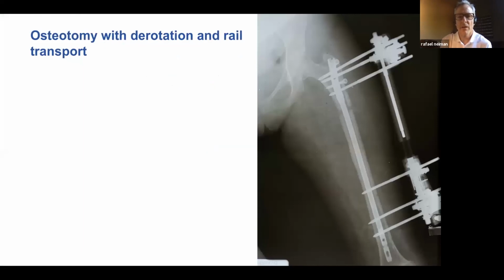She does get a rail, but with an intramedullary nail. This is the smallest nail that I could get for her, which is still kind of big. I think it's an 8, and it happens to be a tibial nail. Is that a problem, to have a big nail with these pins? It certainly is harder to avoid having the pins cross the nail.